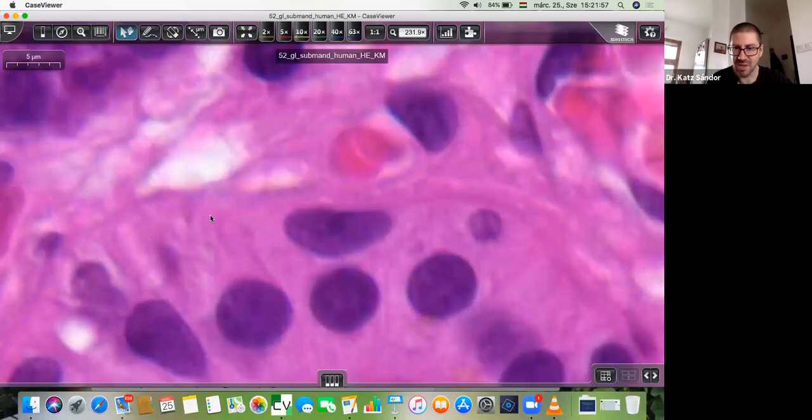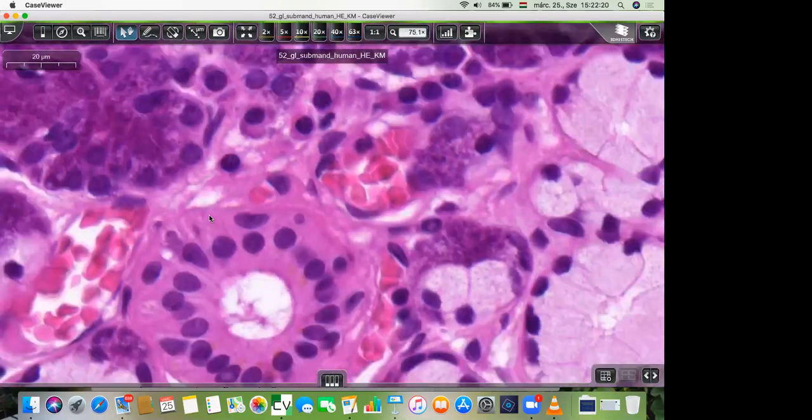This is the striation. But we need a really good light microscope to show them. This is eventually an electron microscopical structure, I mean this striation and the mitochondria. So definitely we can see the mitochondria. Okay, thank you. You're welcome.